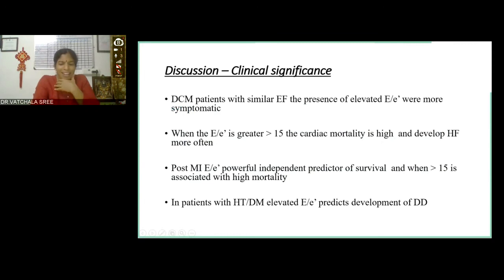Now, I told a friend of mine that I'm going to give a talk about diastolic dysfunction, and he's an interventional cardiologist, and he mocked me saying, "What are you going to do by knowing diastolic dysfunction?" So, first of all, when you assess the diastolic dysfunction and try to fit them into the guidelines recommended protocol, I think your reporting becomes more precise, more sophisticated, and more academic.